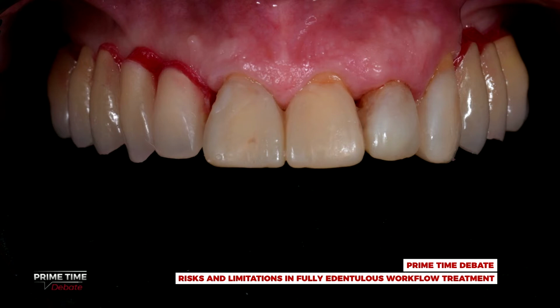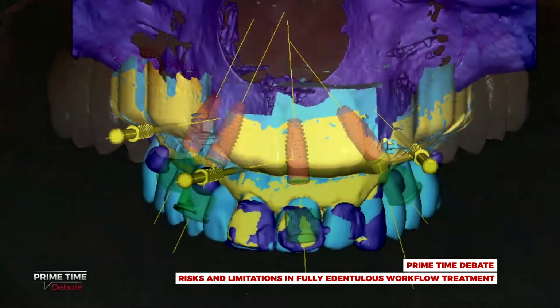Once we have decided and agreed on this result along with the patient, who must be happy to wear these beautiful teeth, we can forecast this situation in the final rehabilitation. At this point, this will be the base of the whole treatment.